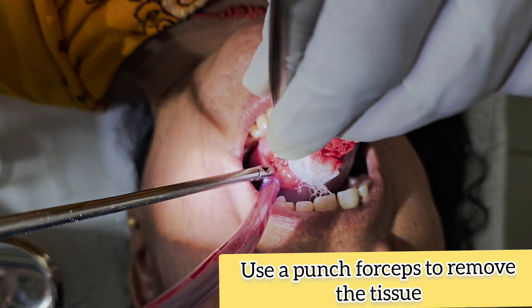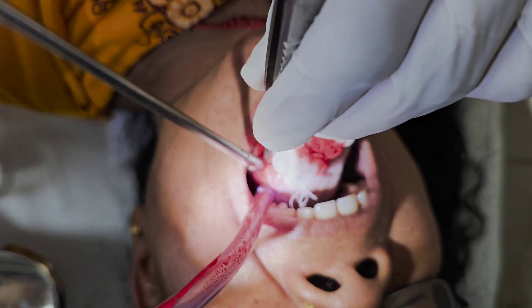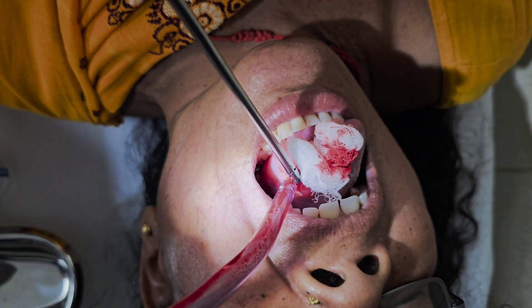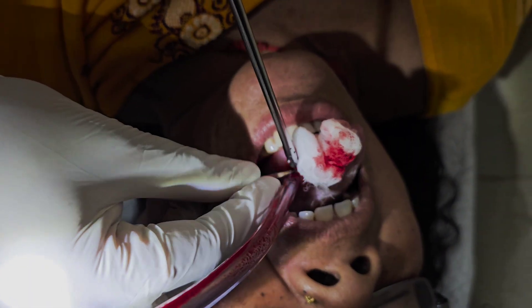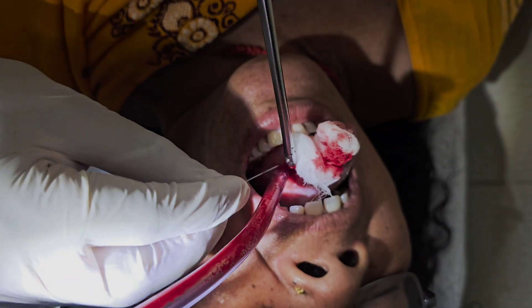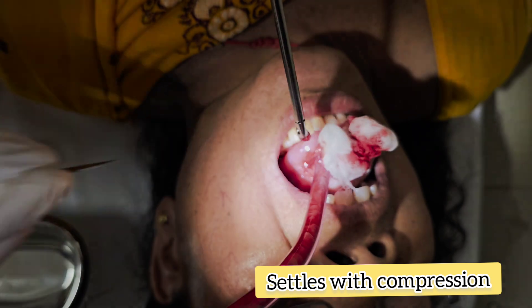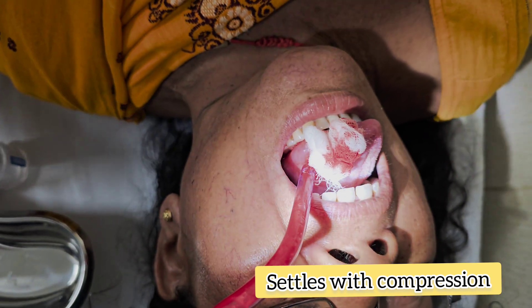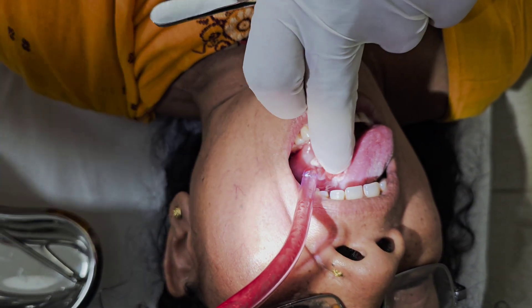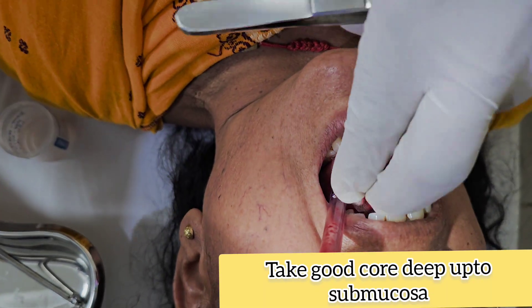From the same incision, the incised tissue, you can take a few punches. There might be some bleeding but this bleeding is generally not troublesome — it settles with compression. We have taken a good chunk of tissue which should be sufficient for the biopsy and for diagnosis.